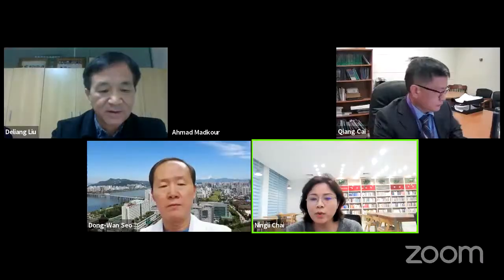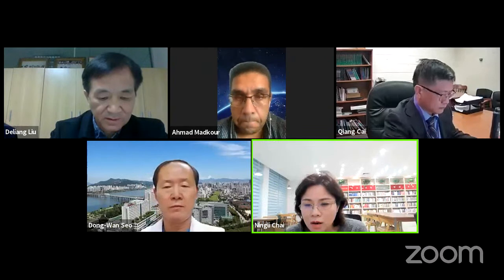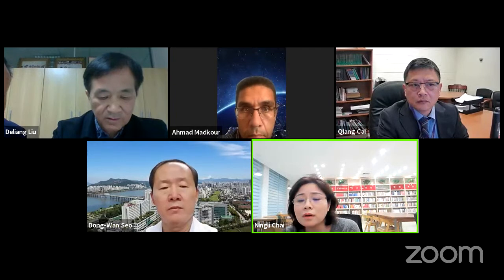Okay, thank you for your lecture. And there are some questions. One question come from the chat box. The question from Dr. come from Actina. His question is the poem post if the poem is failure, how to do, and if some difficult associated with a worse efficacy.